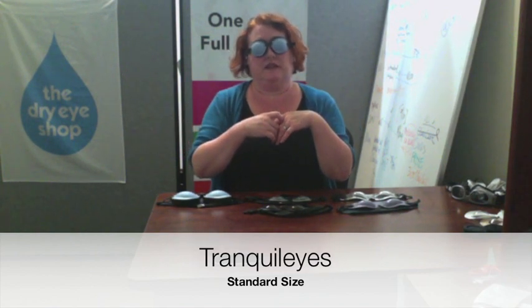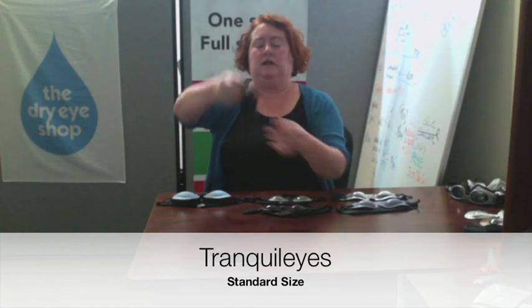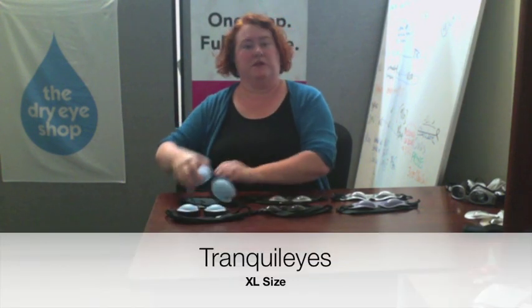And depending on the depth of your eyes, those pads may also be contributing to help hold lids down in some cases. They can be supplemented with some extra pads if you need a little bit of pressure, if you've got deep set eyes. They can also be trimmed down so that you don't have anything touching your lids if needed. That's the regular size. Here's what the big one looks like.